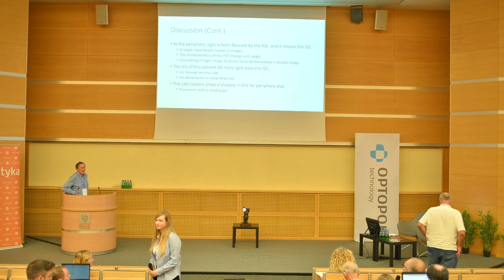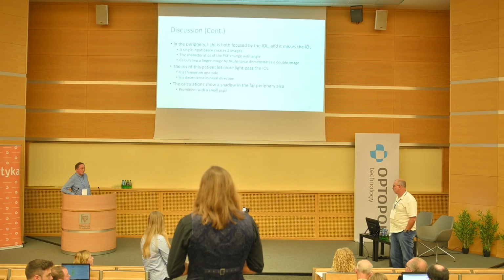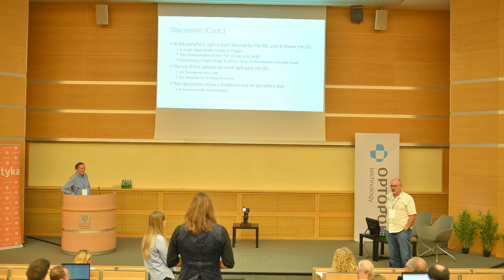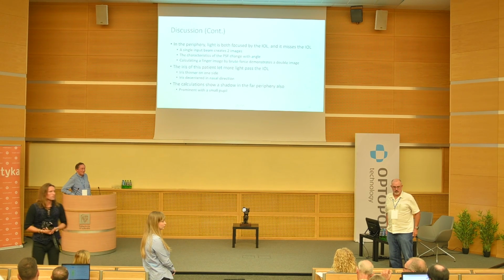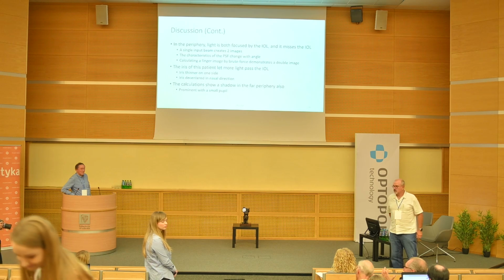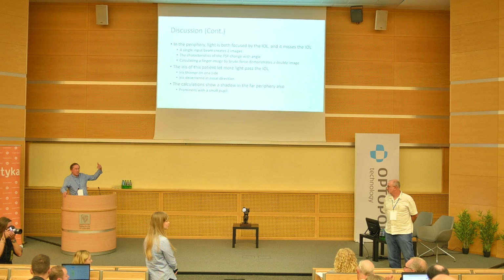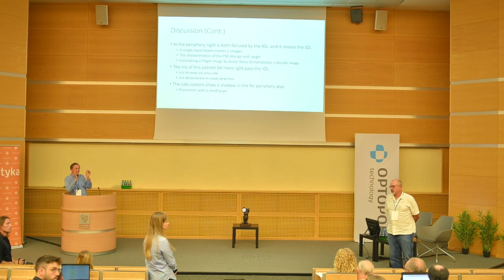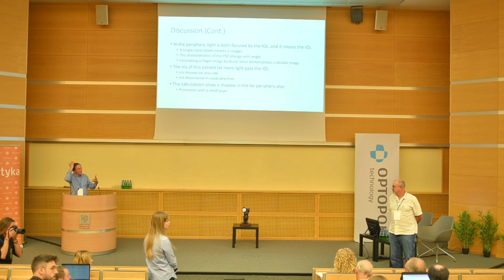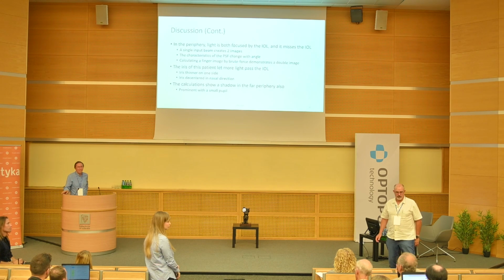So Michael, I'm curious, it seems like what you're really saying is that paraxial optics works very well for these IOLs in the far periphery, but in the real world, the pupil's quite large. Right? No, I'm saying that the paraxial nodal point is not relevant to this use of the nodal point for a very large angle. The cornea is highly curved and the retina is highly curved, and if you have an optical system like that, you get a small angle effect and a large angle pointing effect. But it's not a ray effect. We don't have a concept of a directional ray. Gotcha. Thank you.